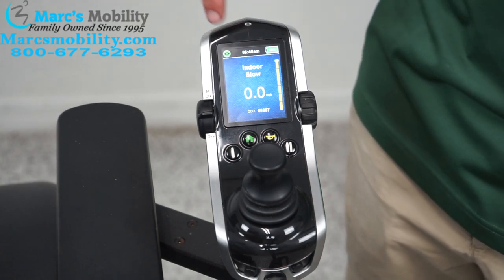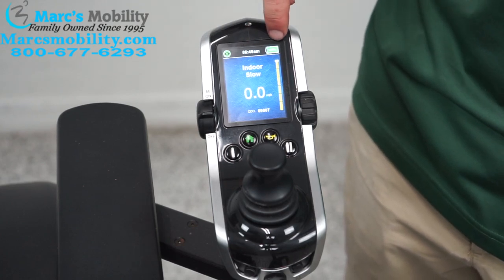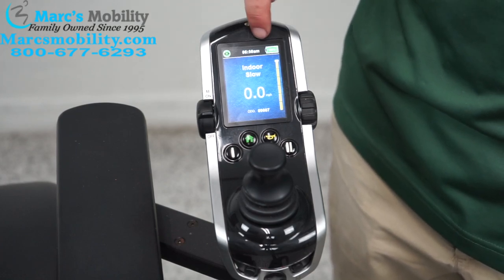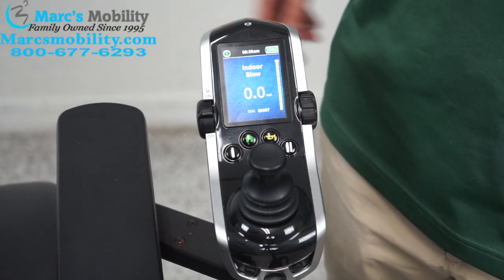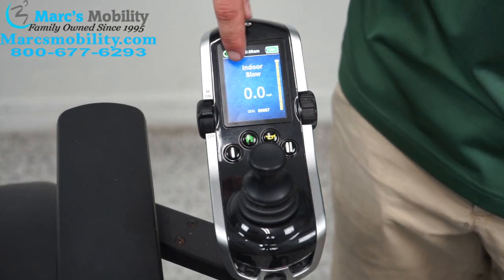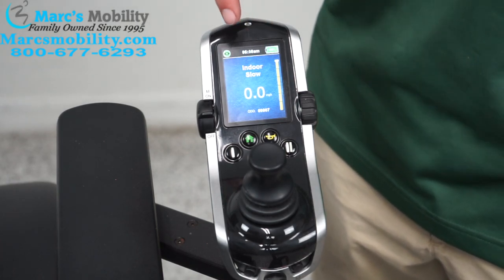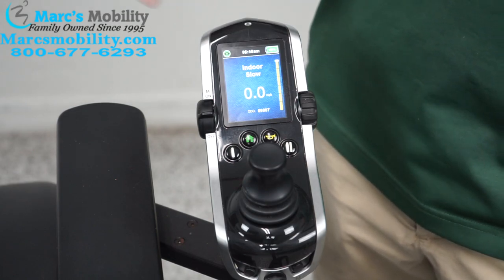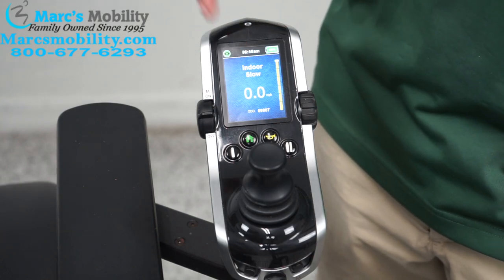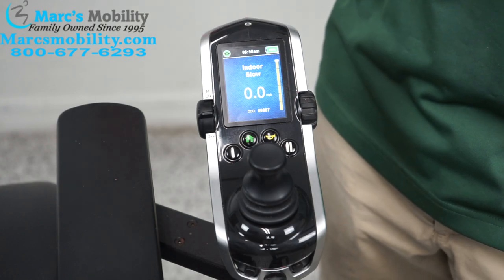Green means you're good to drive. Up top you have your time of day, and to the right is your battery indicator with a percentage — I am green with 100%, meaning the battery is fully charged. On the main screen we have different profiles. We are currently on indoor slow, which is the slowest profile with a top speed of about one mile an hour. There are four profiles: indoor slow, indoor moderate, outdoor moderate, and outdoor fast.